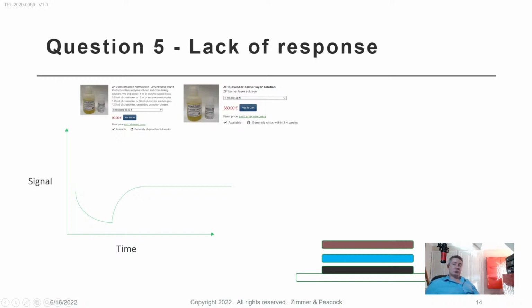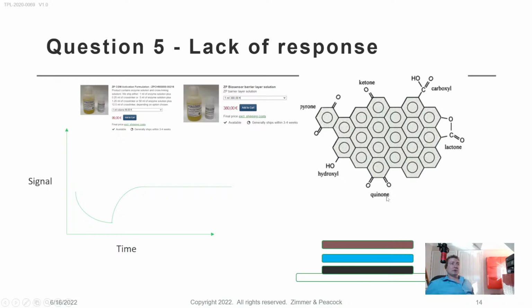So now, which is good, this is part of why we do these webinars, we've actually found out that the electrode they're depositing onto is a carbon electrode. So the formulation we've given them is for what's called a generation 1 glucose sensor. A generation 1 glucose sensor means that you have glucose oxidase, it reacts with the glucose in the presence of oxygen, and you get hydrogen peroxide. Hydrogen peroxide can then be detected on a platinum electrode at 650 millivolts. So this person is probably applying a voltage of 650 millivolts, but it's a carbon electrode.